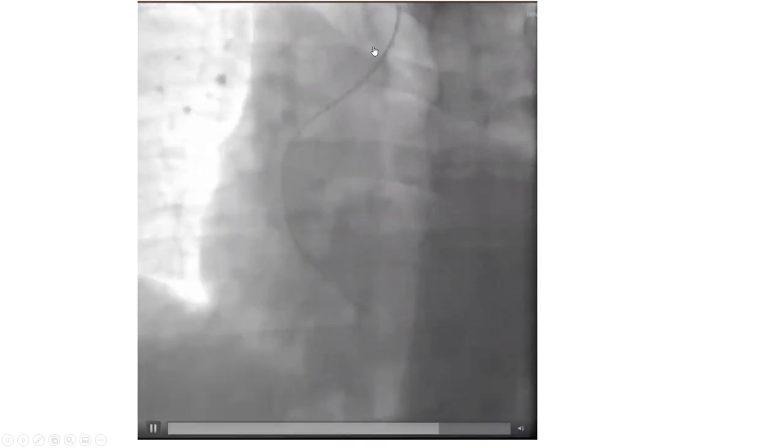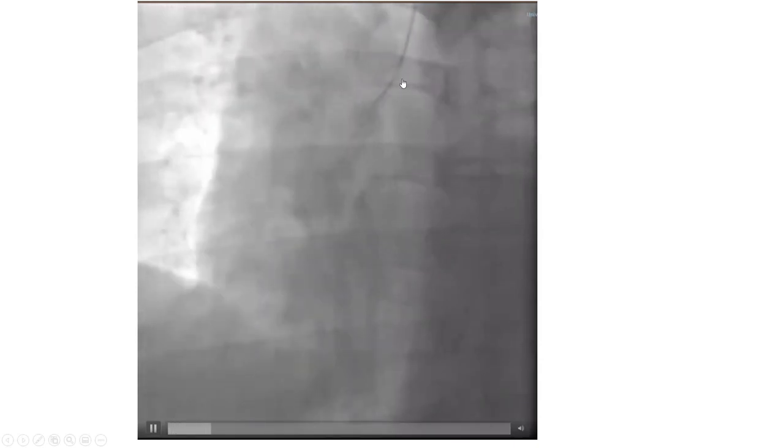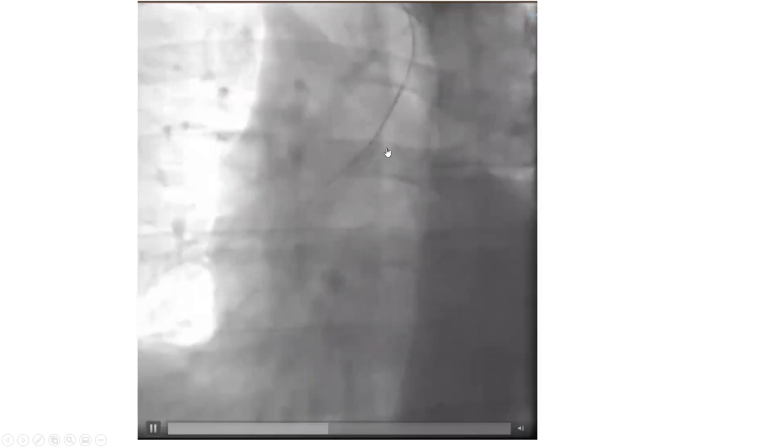Here's another case of difficulty advancing over the aortic valve — easier than the other one, though. We did a deep breath and a torque maneuver and got onto the valve. Initially the catheter was pushed and everything wanted to fly out, but with deep breath and the torque we were able to get it down successfully.